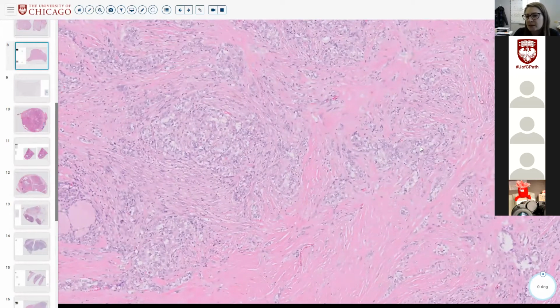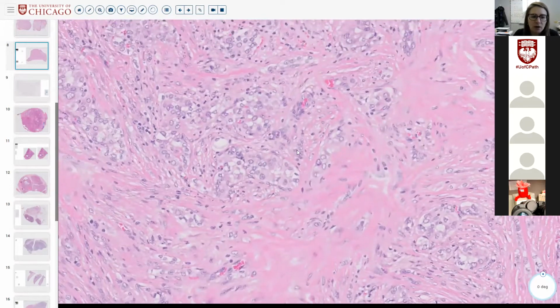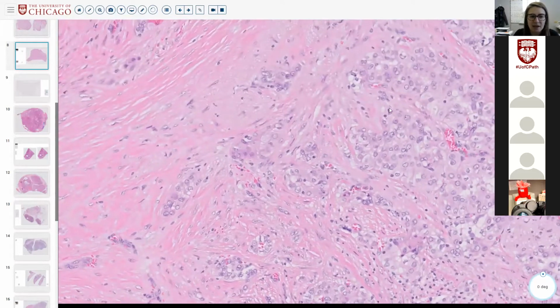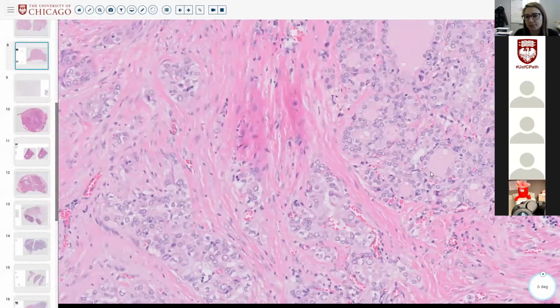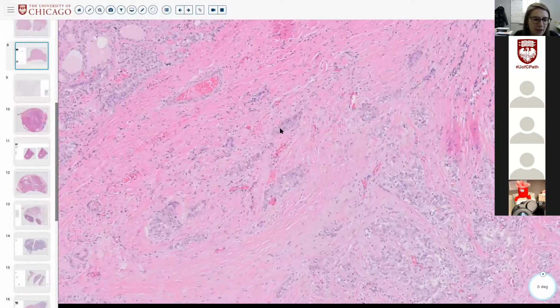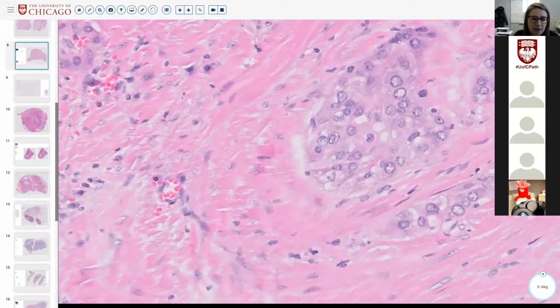And yes, it's basically a desmoplastic stromal response to carcinoma. So overall, all of the architectural and cytologic features to me say that this is carcinoma, regardless of whether the BRAF is positive. In this case, it happened to be. And if Tanner can find his inclusion and send it to us, that might be one.